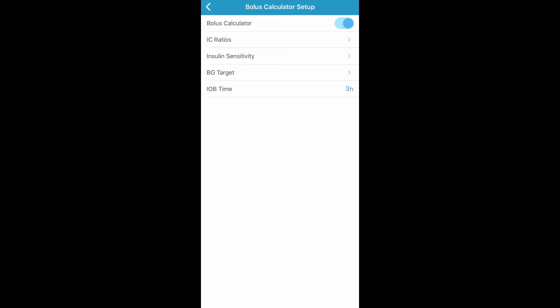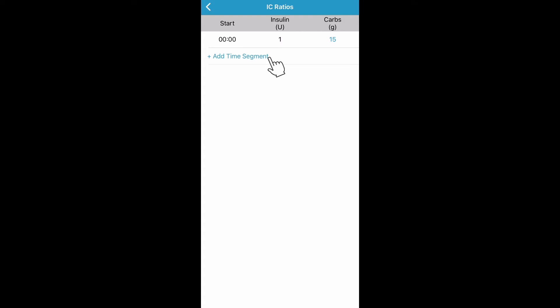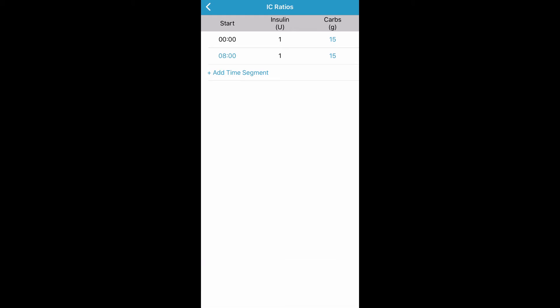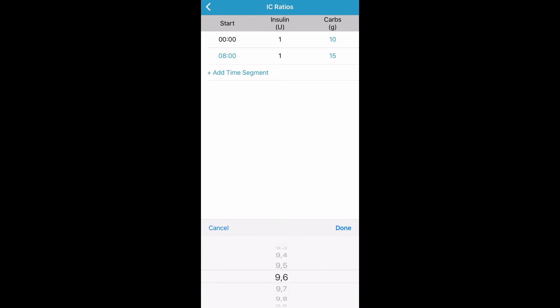Now you can set up your insulin to carbohydrate ratio for your pump by tapping on IC Ratios. You can add up to eight different time segments for the day depending on your need for different ratios at different times. Tap Add Time Segment to add a new time segment. You can adjust the ratios for each time segment by tapping on the blue number next to each time segment. Once you have entered your insulin to carbohydrate ratio, tap the back arrow.